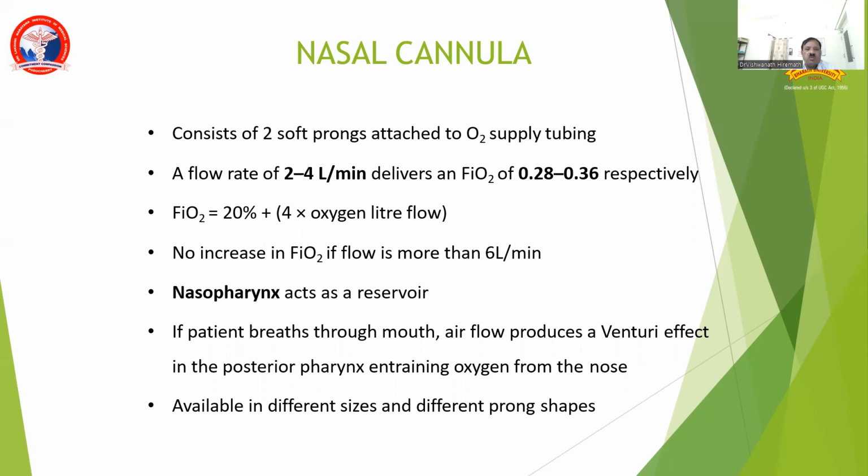Here, the nasopharynx will act as a reservoir. The patient breathes through the mouth. Airflow produces a Venturi effect in the posterior pharynx by entraining oxygen from the nose.